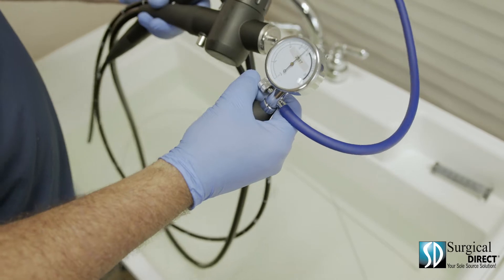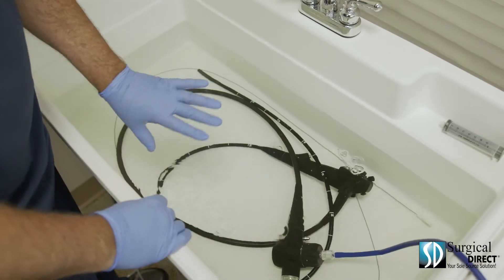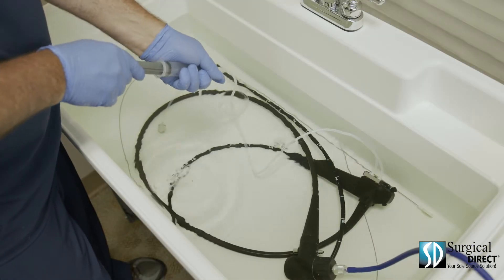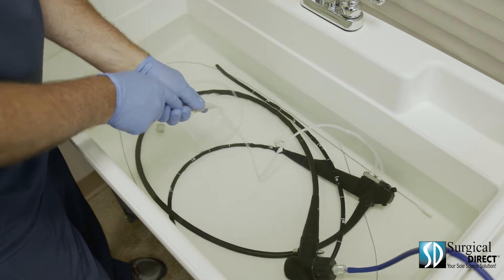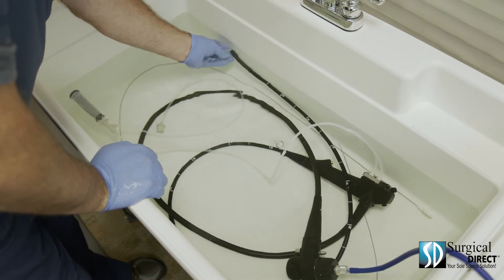With the leak tester still holding pressure, it is now safe to submerge the scope. It is important to always be looking for leaks in the endoscope. Using a syringe and your cleaning tubing, flush all air from all channels of the scope. It's easy to have a false positive when you don't remove all air from the scope.